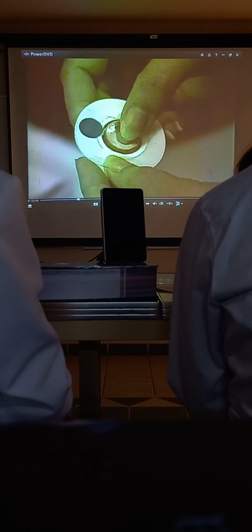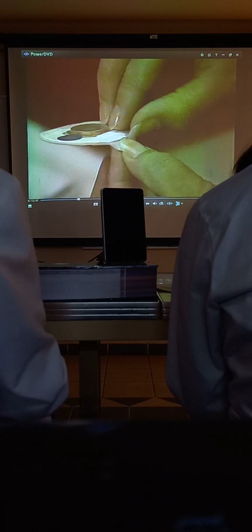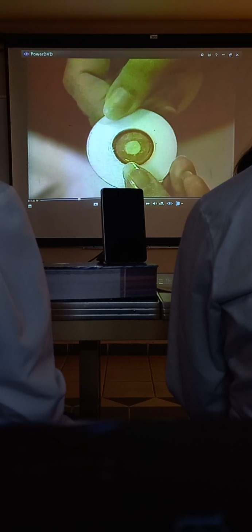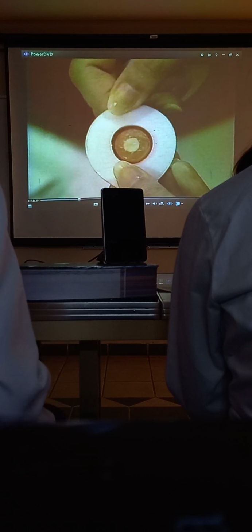A disposable floating electrode used in this demonstration is most commonly used for cardiac monitoring. It has a center cushion filled with electrode paste or gel. The outside rim adheres to the patient's skin. Normally, this type of electrode can be left on the skin for 3 to 5 days.